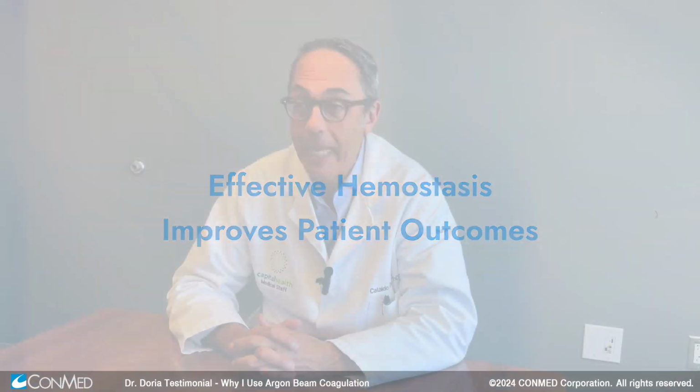Argon Beam Coagulation, by clearing the surgical field of superficial bleeding, facilitates the achievement of these negative margins that we are always looking to offer to our patients. What I can tell you is that hemostasis is very important in surgery.